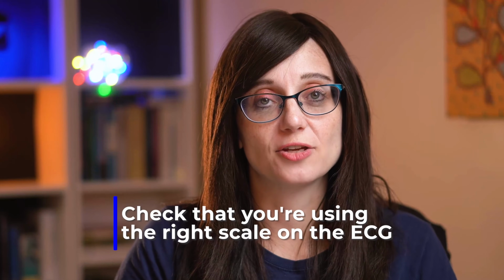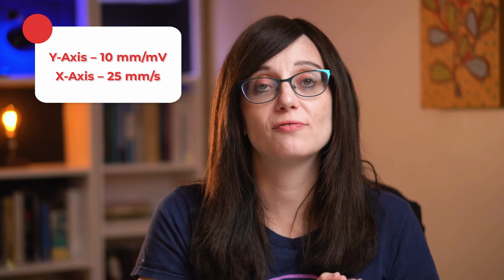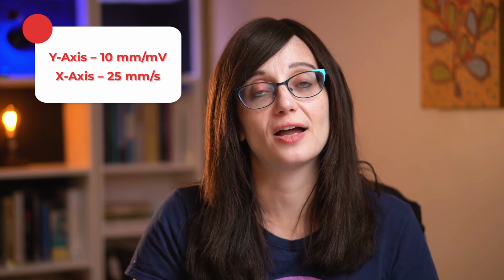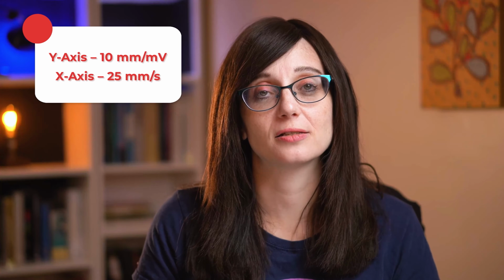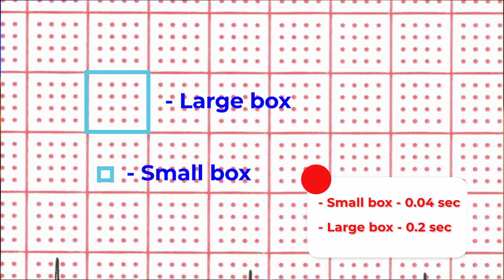Before you start, check that everything's working okay. Check that you are using the right scale on the ECG. Standard ECG should be set at 10 millimeters per millivolt on the y-axis and 25 millimeters per second on the x-axis. Every calculation that we're about to discuss depends on it being at this standardized level. So it's really important to make sure that this is right before you start interpreting the ECG. With the standardized values, one small box is 0.04 seconds.